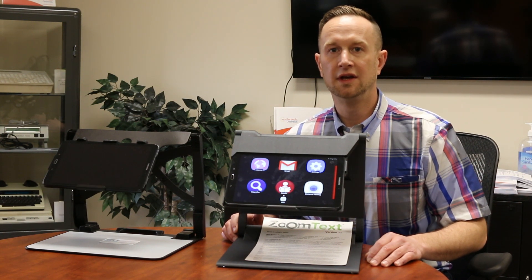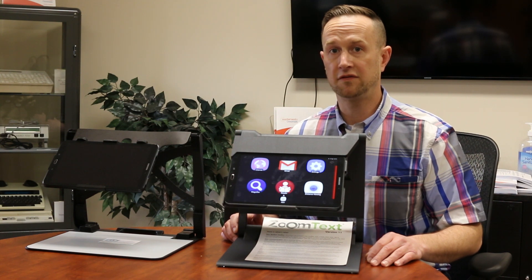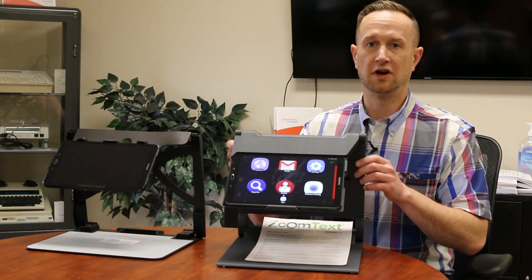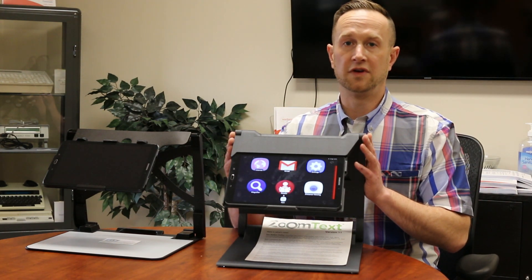I'm Greg Blackman with IPC, and I'm here today to talk about a really exciting new product that we have called the Patriot VRM-10. The Patriot VRM-10 is basically a device that has really a little bit of everything in one.